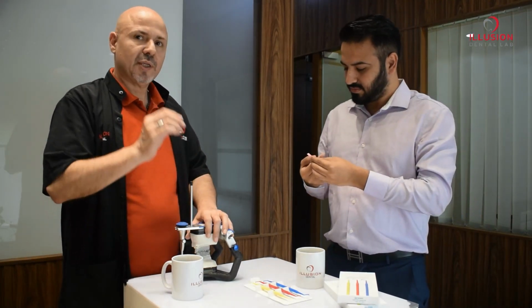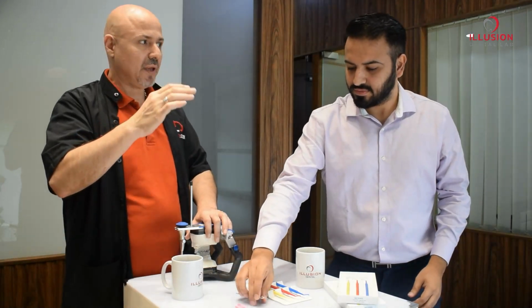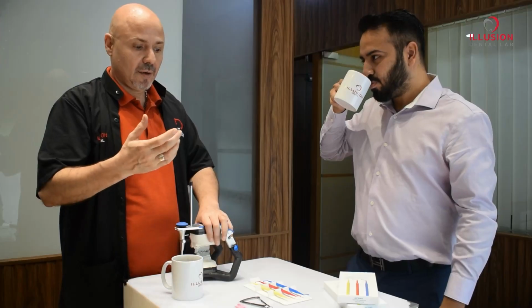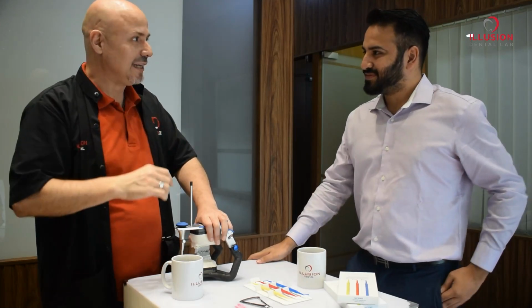I suggest we should really keep the 1 millimeter because we have a little bit of tolerance that we need to keep in mind. We have the virtual cement gap, which is in progress with the evolution of the material and technologies. We sometimes forgot we had this space, and now it's suddenly turned into a virtual space, or sometimes it creates a discussion whether the crown is loose or not loose, but let us get to that in a different session.